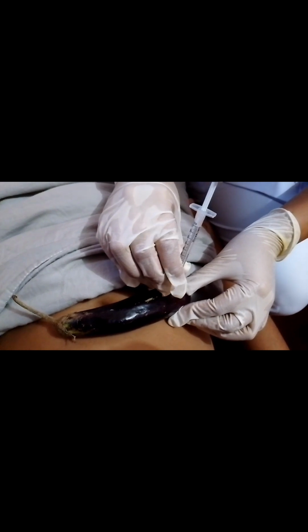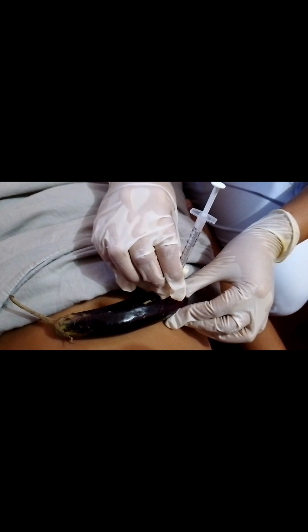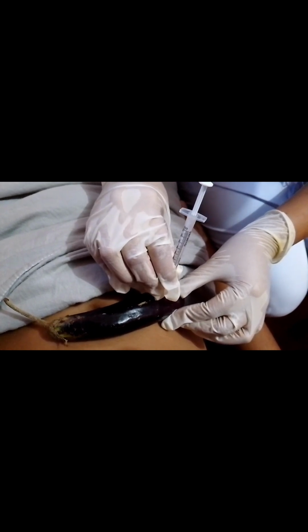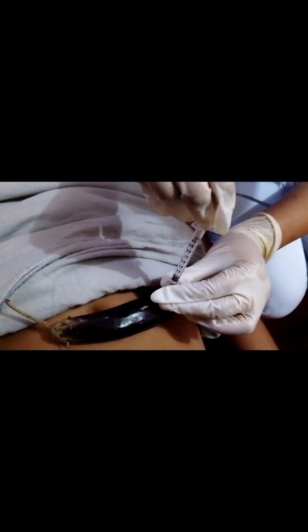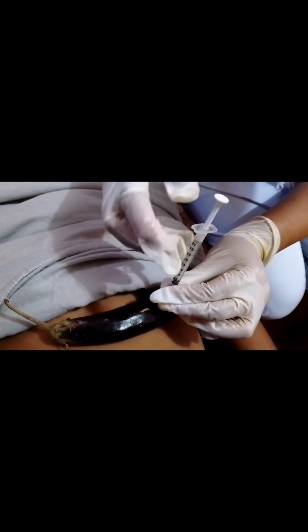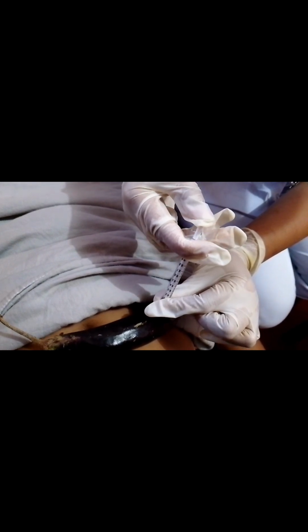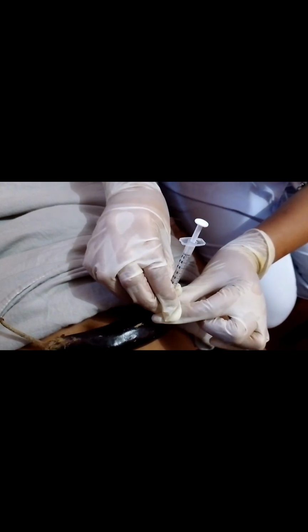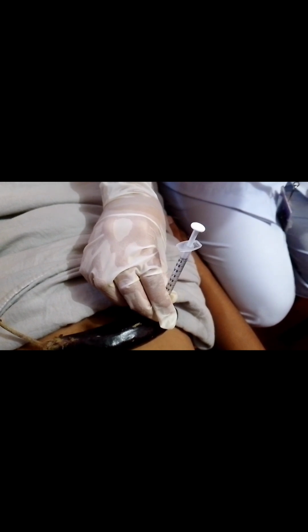And now release the pinched skin and rest the non-dominant hand on the patient. Move the dominant hand to the end of the plunger. And now slowly inject the medication. In several seconds, retain the grasp on the syringe. Now quickly withdraw, and then place a swab and don't massage the area.